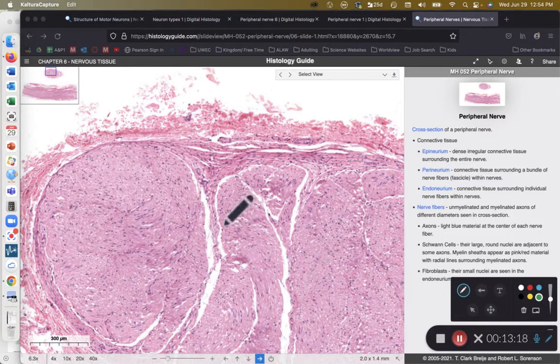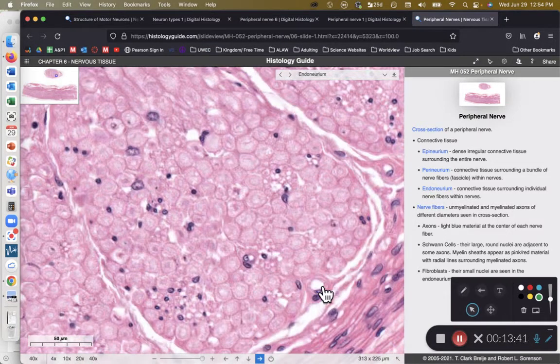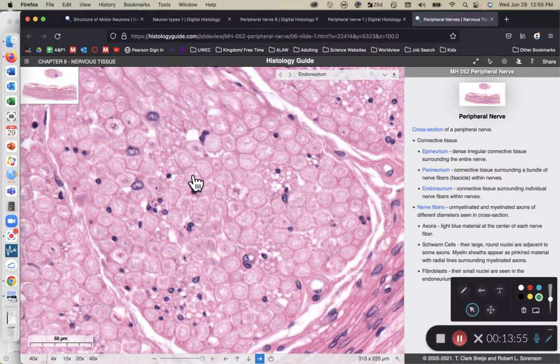So what I like to do to make things extra clear on the lab exams, I typically like to point to a perineurium that is right in between fascicles, or if I go for a most superficial view or most outer view, like I have in this top arrow, that would be an epineurium. The endoneurium is more difficult to find. That's going to be wrapped around individual nerve fibers. So to find the endoneurium, you've got to zoom in close. The endoneurium is the pink band around the myelin sheath gap that goes around the axon. So we have a bunch of myelinated axons in this view. Wrapped around the myelin is the endoneurium.